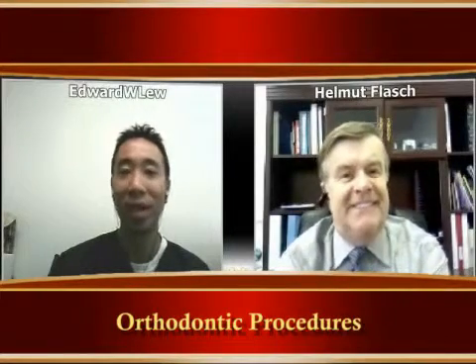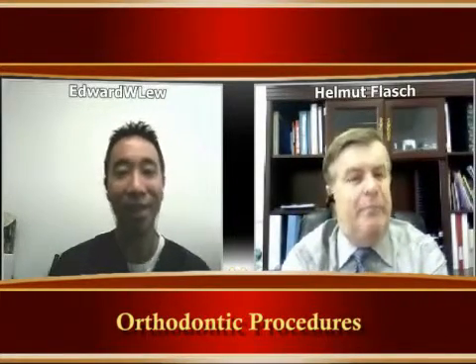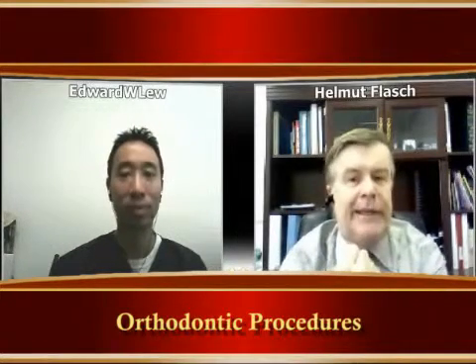Well, Invisalign is known as clear braces. Basically, these are liners made of a certain thermoplastic that move your teeth. One of the biggest advantages that patients love is it's a little more cosmetic. You don't see the metal braces on your teeth. You do wear it all day, 24/7, but the great thing about it is you can take it off when you eat, take it off when you clean your teeth, so it's a little more hygienic. Patients can clean their teeth at least. Yes, that's what they love. So you don't have the spinach flag waving after dinner from the metal braces anymore. No food will be stuck in the metal braces anymore, because there are no metal braces, and you take off that aligner.